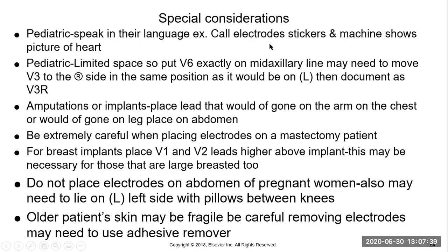So this is special consideration. When you're working with little kids, you want to speak in their language. Rather than calling those electrodes, you might call them stickers. And you might say, hey, this machine just kind of shows me how your heart works. It kind of gives me a picture of your heart. You wouldn't want to get all technical with them. You want to keep them calm, right?